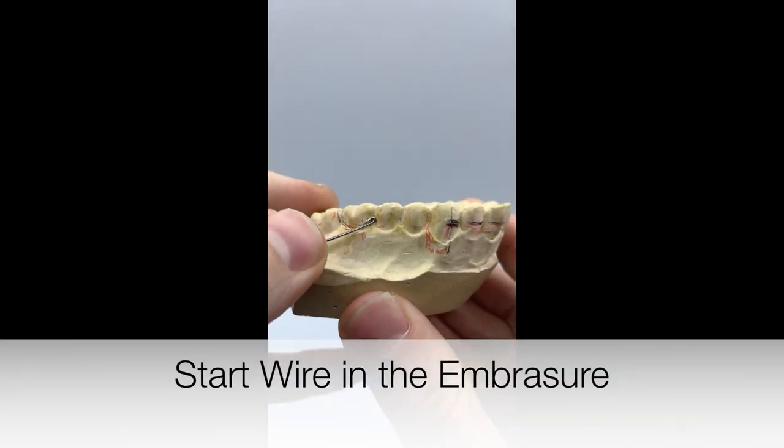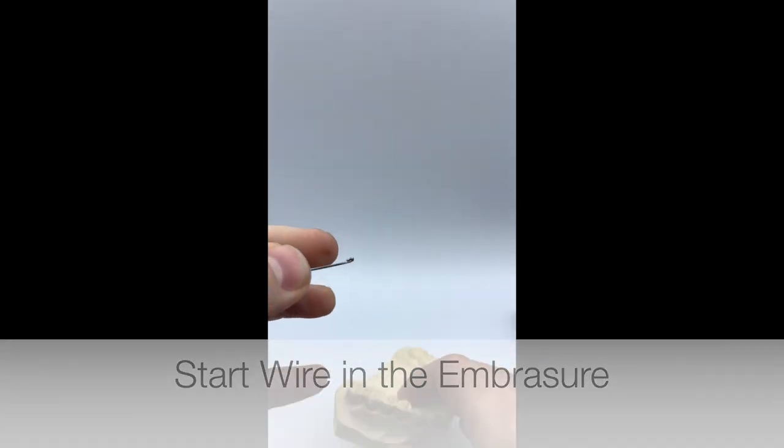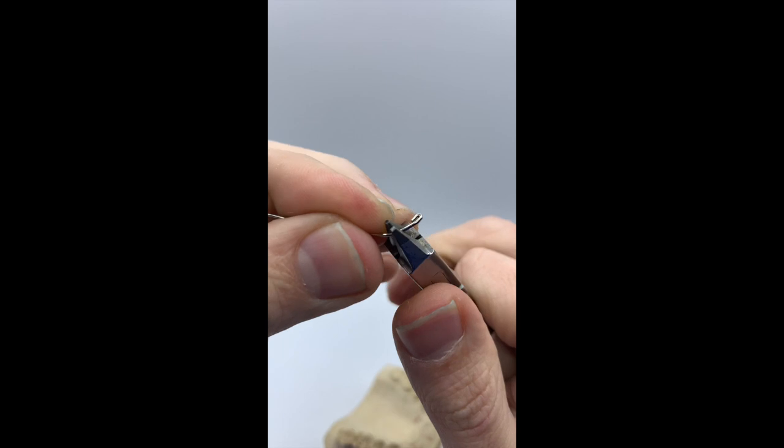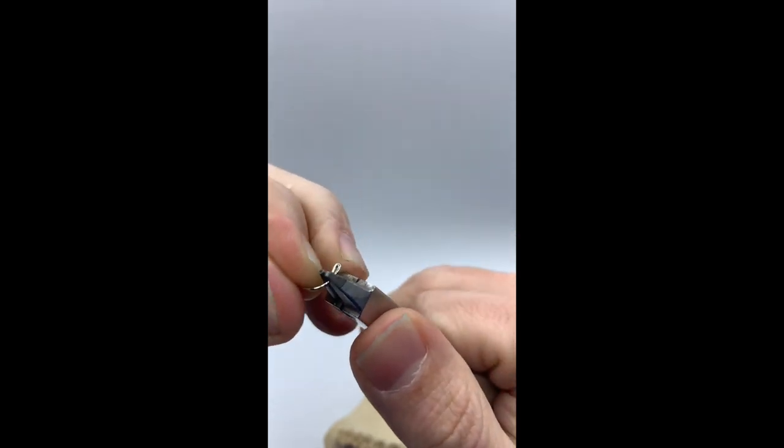When you bend your wire you want to start in the mesial embrasure of the first molar. And with a short series of bends, make a short arch following the buccal contour of that first molar.